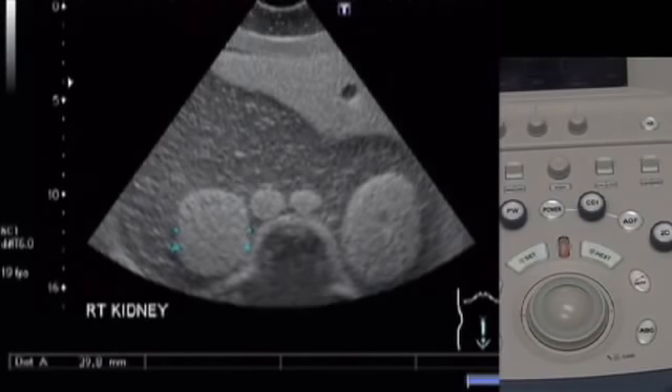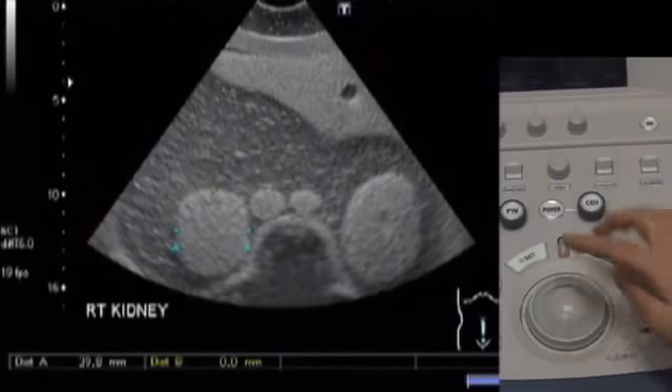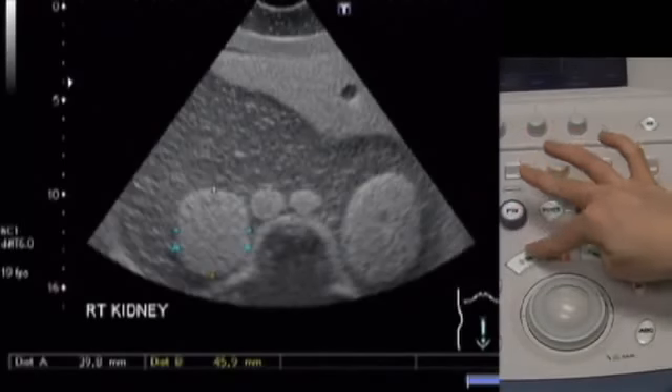If you want to measure another part of the object, press Next and then measure another part the same way: use the trackball to move the cursor, press set, move the cursor to the other edge, and press set again.